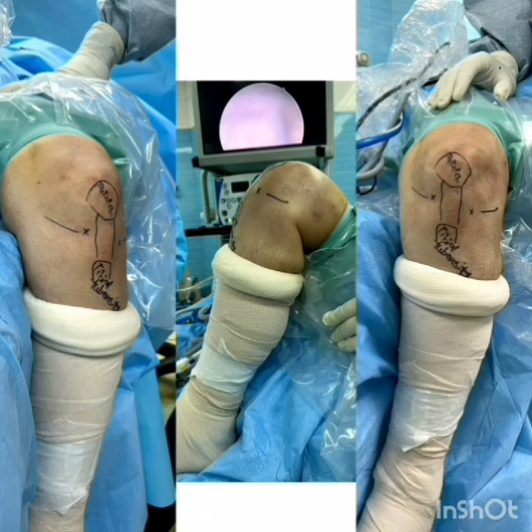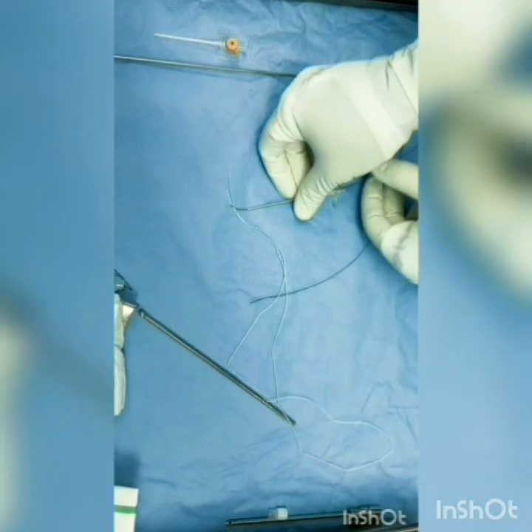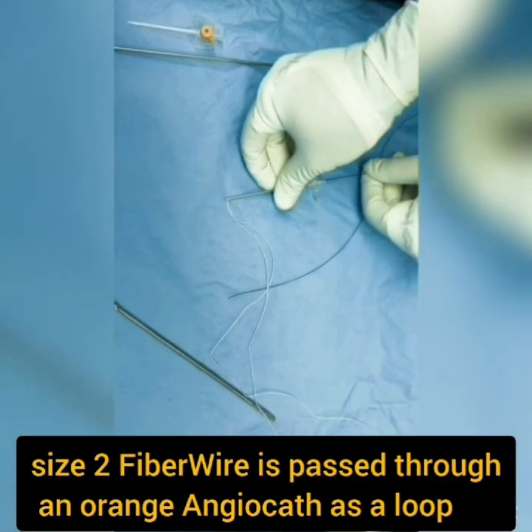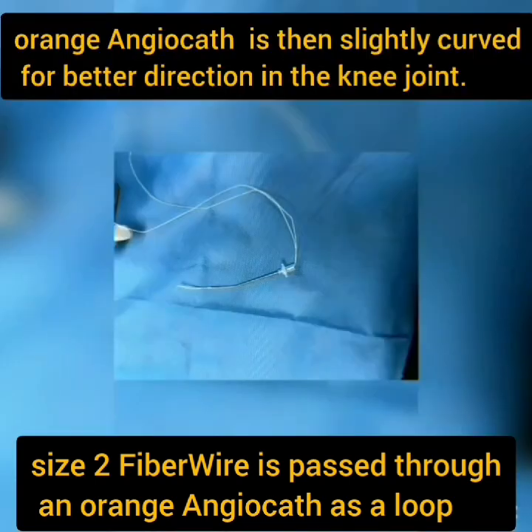Arthroscopy commences with a routine anterolateral portal, and a low anteromedial portal is placed. A size 2 fiber wire is passed through an orange angiocath as a loop, which is then slightly curved for better direction in the knee joint.